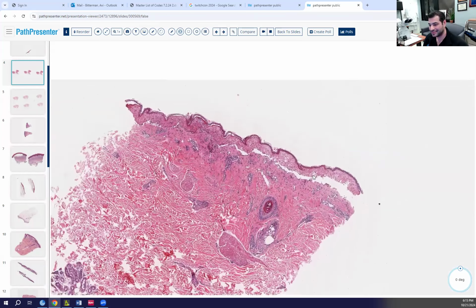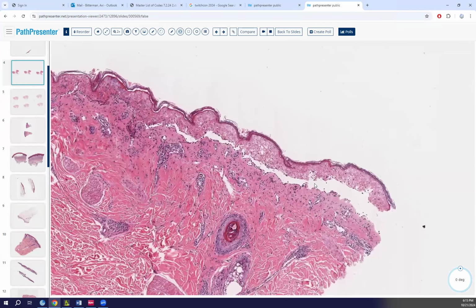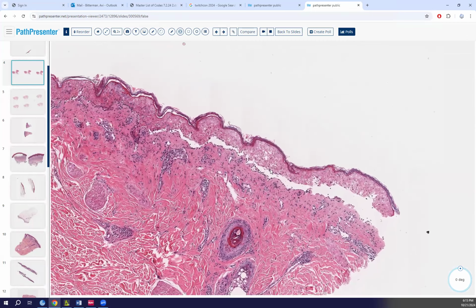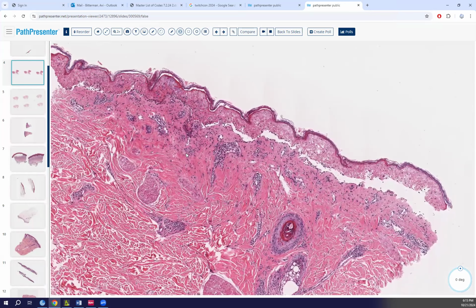What about this? This is a punch and also subepidermal. There doesn't look like there's a lot of infiltrate in the actual bulla itself. There is some superficial, you say also perivascular, lymphocytic infiltrate.